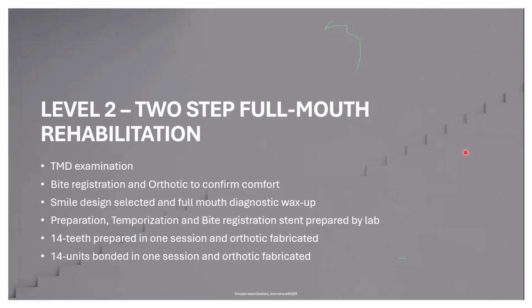We do a full mouth diagnostic wax up. So the lab usually waxes up the upper and lower arches. During the course, we talk about how to prepare the upper arch, how to temporize the upper arch, but one of the big things is how do we record the bites? We don't want to lose that maxillomandibular relationship.